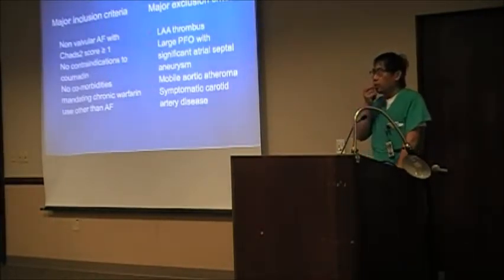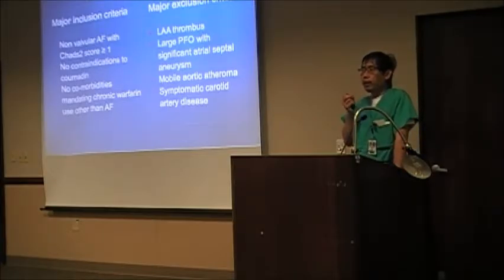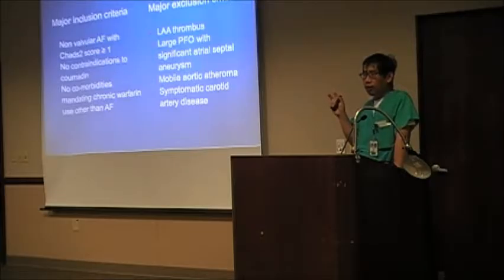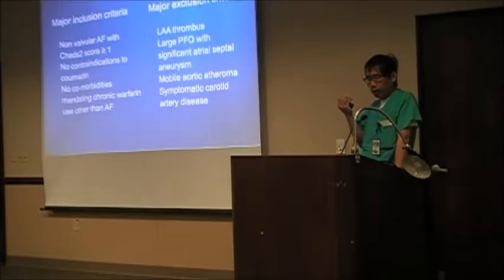So usually you will see who will be candidate for this device. I just give a slide from a clinical trial, the PROTECT AF trial for Watchman. The major selection criteria is that they have risk for stroke, and the patient needs anticoagulation.